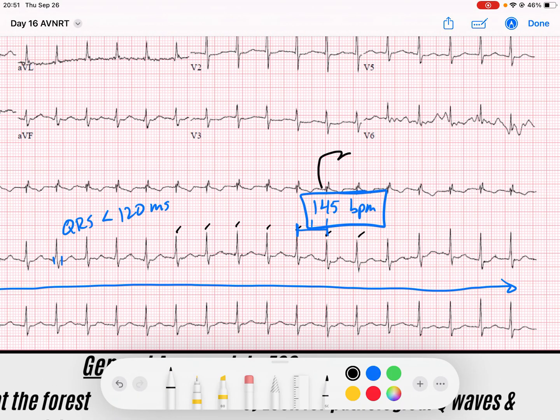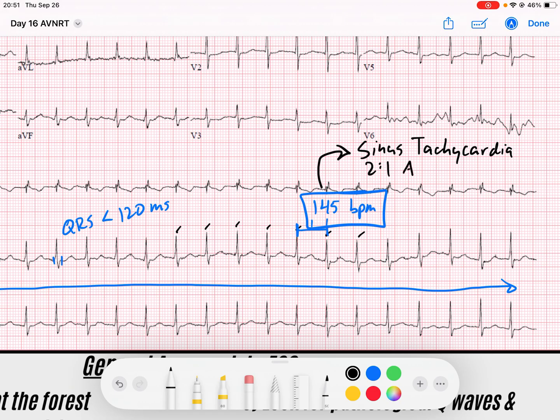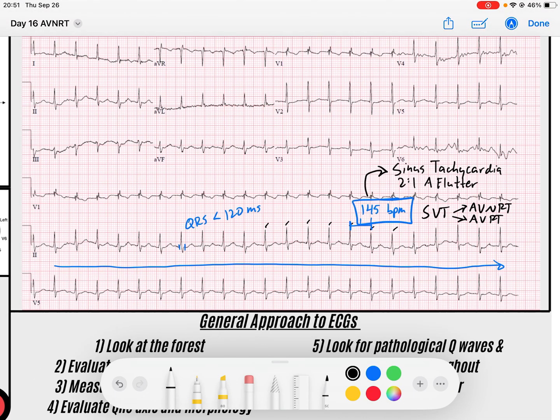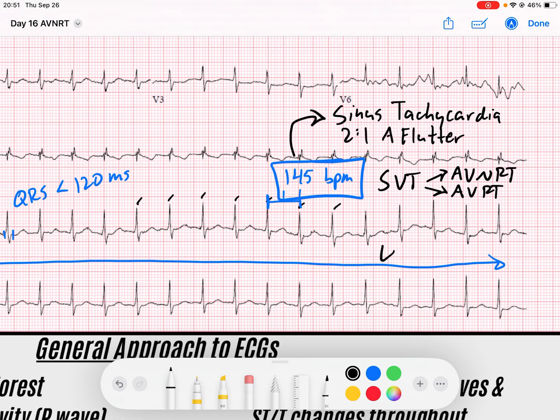So whenever I see a narrow complex rhythm at 145 beats per minute that is regular, what does our differential include? Well, it includes sinus tachycardia, two-to-one atrial flutter, forms of SVT such as AV nodal reentry tachycardia or AV reentry tachycardia, and also ectopic atrial tachycardia.